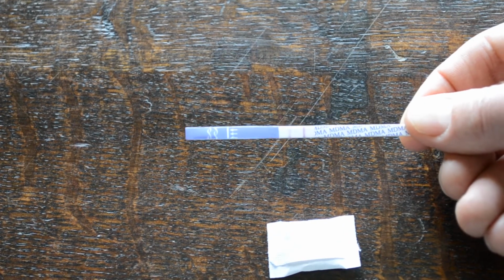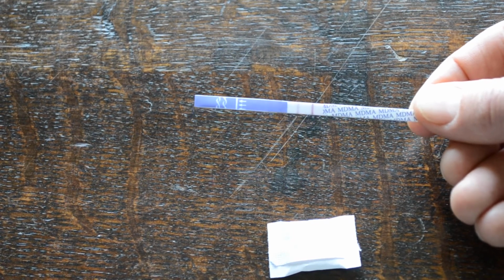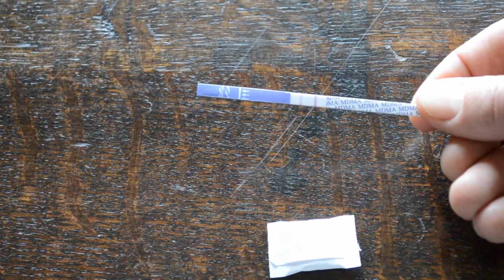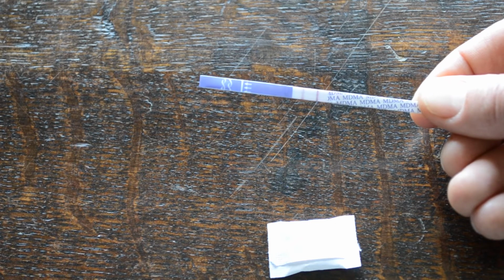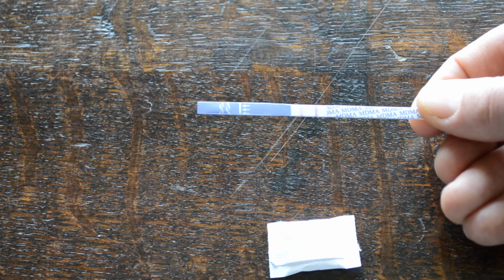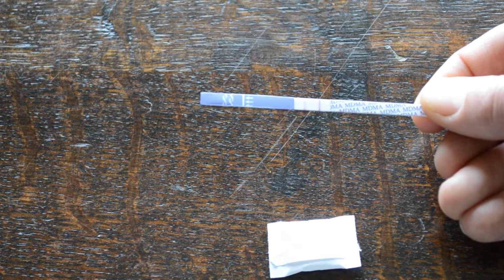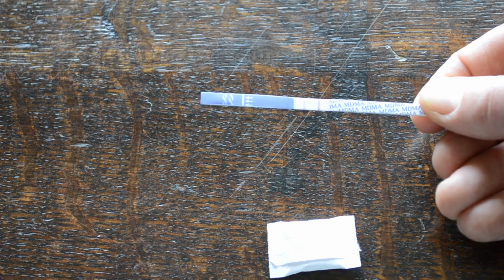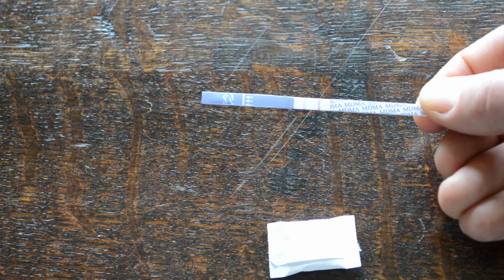The accuracy of these tests in terms of detecting ecstasy, you've got a window period after use of between 3 and a maximum of 5 days, over which you would expect the test to return to negative. So you can't detect it in urine for more than 5 days after use. You would expect a positive test to occur after consumption of ecstasy within 1 to 2 hours in a urine sample, and then to stay positive, as I say, for up to 3 days, maximum of up to 5 days.